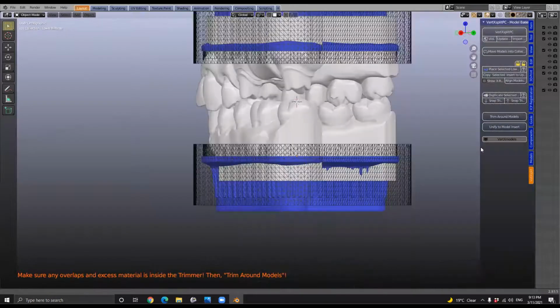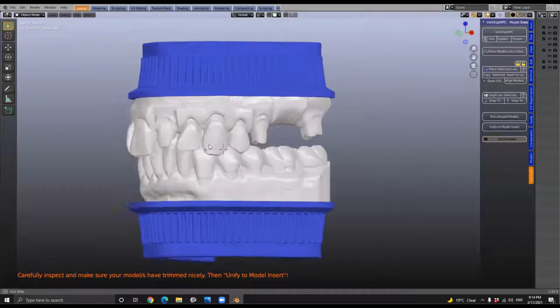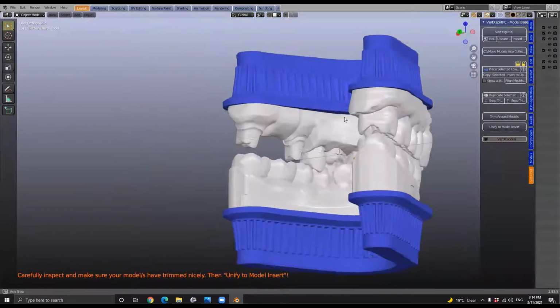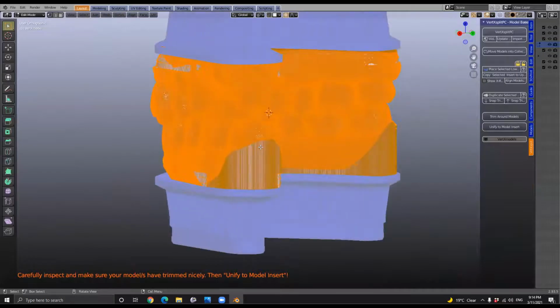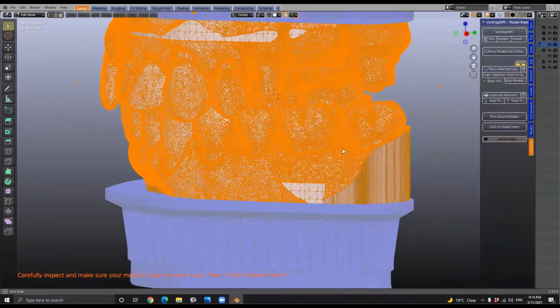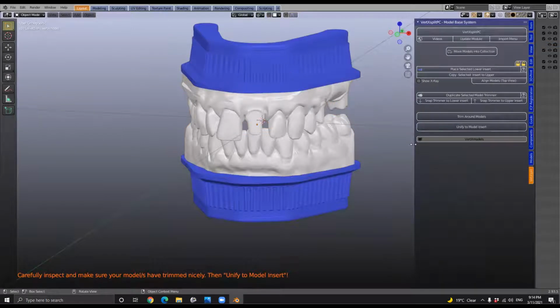Okay, let's see how this works. So we're going to trim around models. We'll just wait for it. Now these are standard Boolean cuts, and this is trimmed nicely. Notice how it's actually trimmed away all around it. Can you go into edit mode to show the mesh, Michael? The differences in the mesh, after you've unified it. Yeah, so you can see we've got various structures in the mesh here. The mesh is rather simplistic, especially in the insert, to speed up the cutting processes.